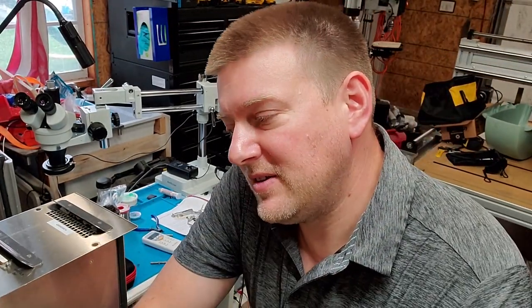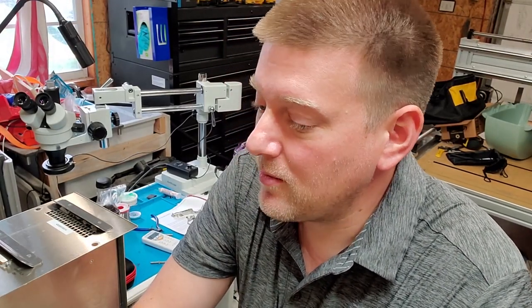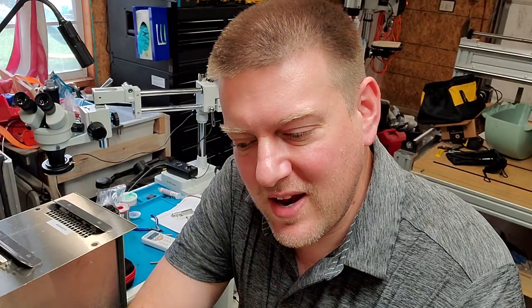Let's start with the PC and let's tear into it, see what's going on with it. And when we're done, we'll go ahead and tear into the motor. So let's do that. Coming up next, right here in Better Biomed.